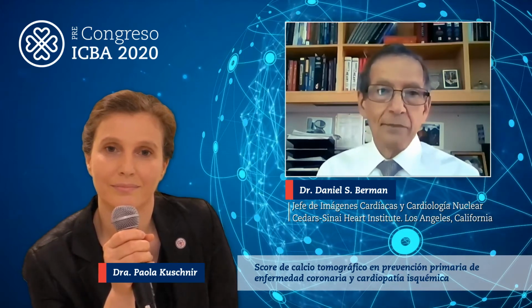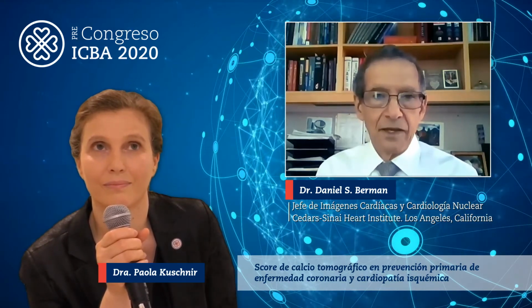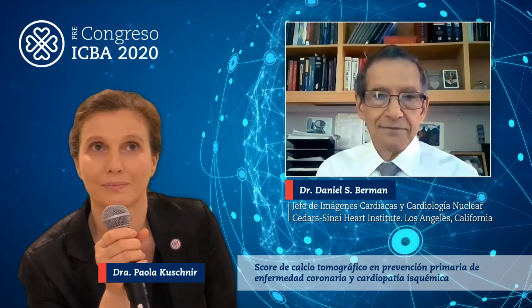Essentially, it takes more time to get the patient on and off the table than it does to do the scanning. So this scan is a non-contrast scan. There are no injections of anything, no requirements for fasting and that kind of thing. So it becomes a very inexpensive CT scan.